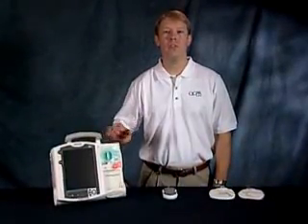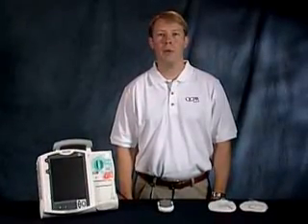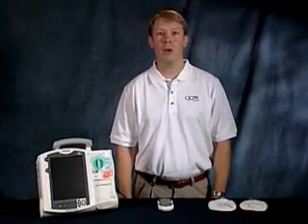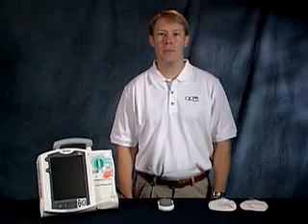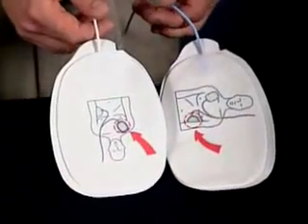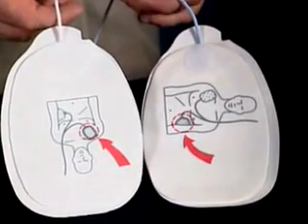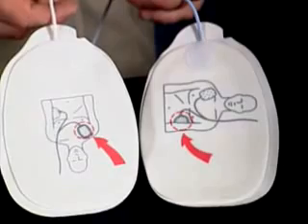Today I'm going to talk about QCPR, which offers measurement and feedback for both of the primary components of CPR, both chest compressions and ventilations. To measure ventilations, the MRX uses standard defibrillation pads. These pads can detect changes in chest impedance, which correlate to ventilation volume.